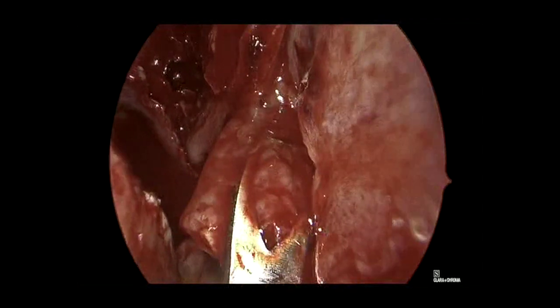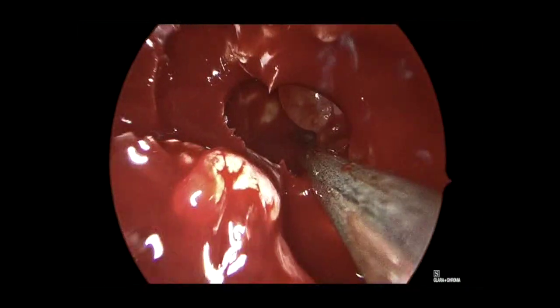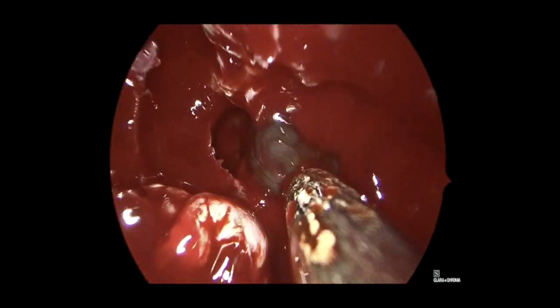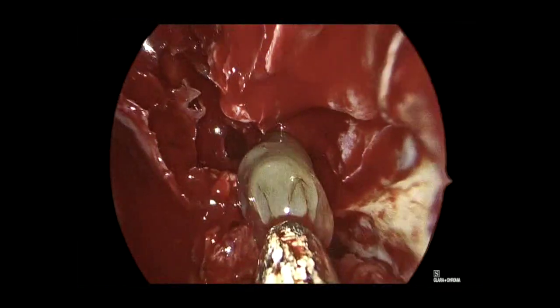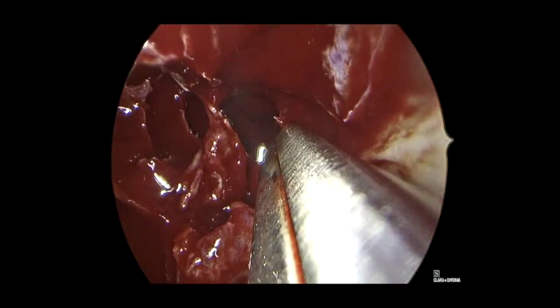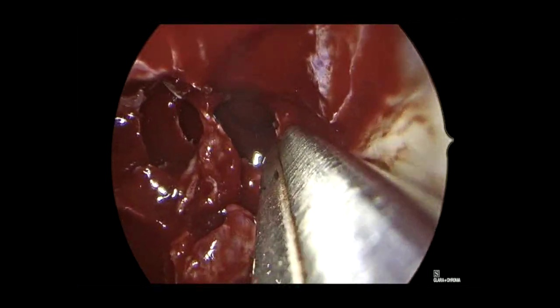Now here we are opening into the right sphenoid sinus. As is typical, there's a fair bit of inspissated secretions within that sinus. And here we are extending that a little bit towards the left side and to the back of the nasal septum.